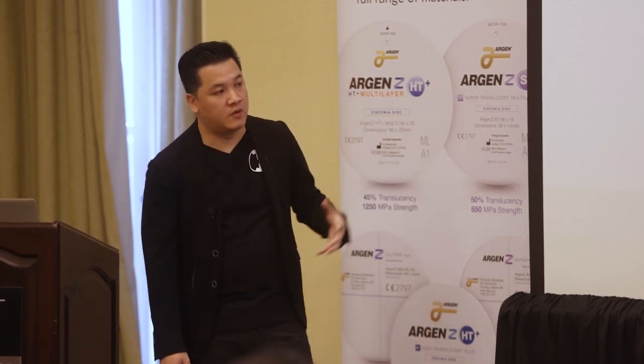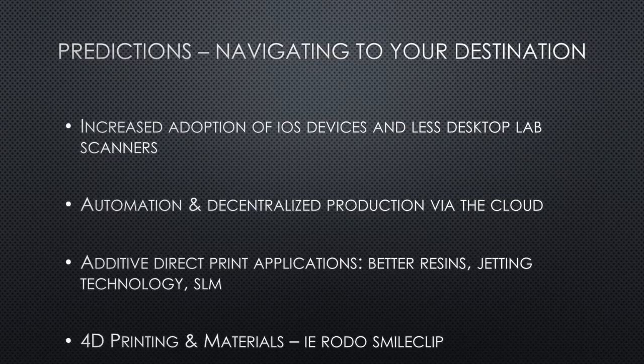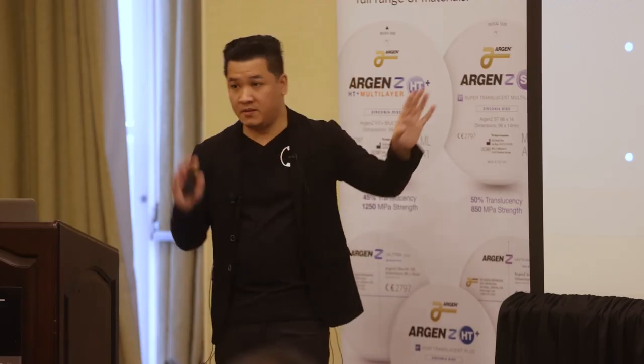I really think that's the way of the future and how our industry is going to be moving. A couple other things, of course, in that video I showed you in the beginning: increased adoption of intraoral scanners and fewer desktop scanners. Like I said, we'll always have a desktop scanner in the lab. You're going to see a lot more automation, a lot more decentralization. These things will go up in the cloud. I can send them to printers and doctor's offices. I can have these things milled.